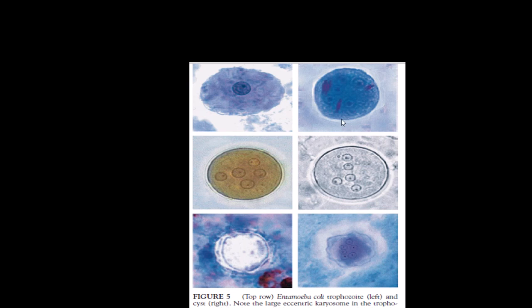So the microscopic differentiation between those is extremely important. Entamoeba histolytica versus the non-pathogenic ones.